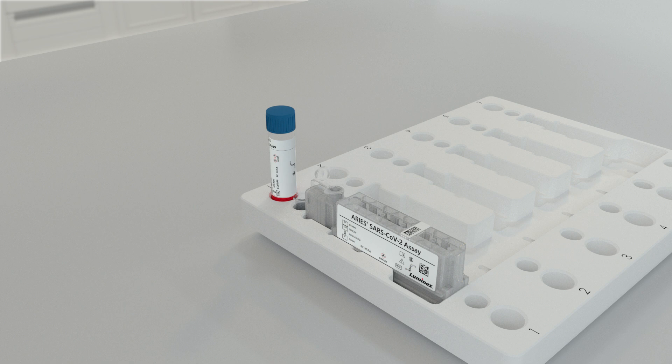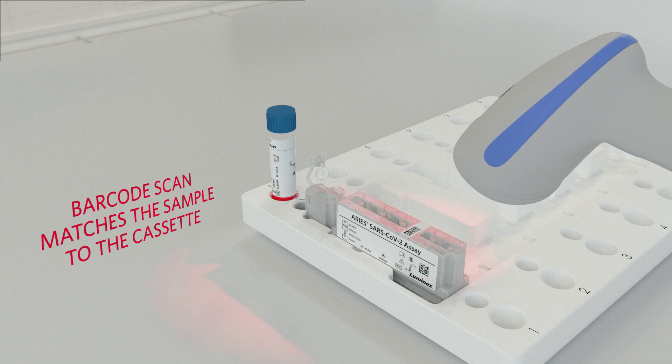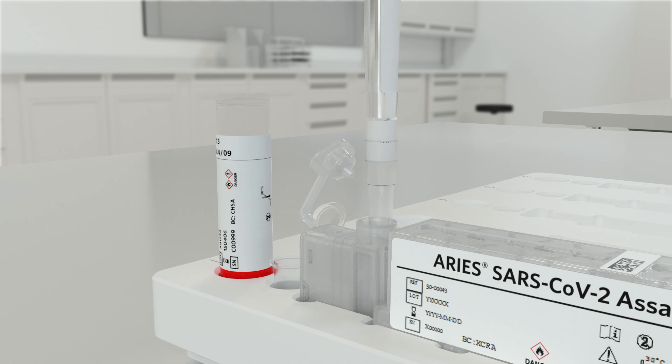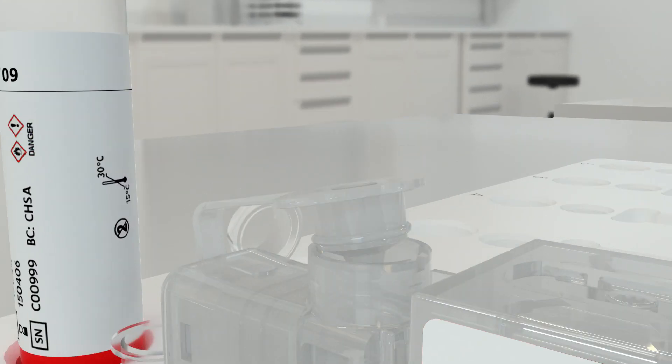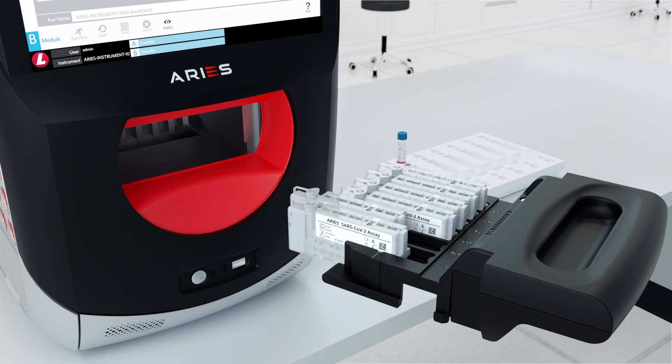The steps to run the ARRI SARS-CoV-2 assay are simple. To begin, scan the sample tube and the ARRI cassette barcodes, which matches the sample to the cassette. Next, pipette the sample into the cassette and close the cap. Then place the cassette into the magazine and insert the magazine into the ARRI system.